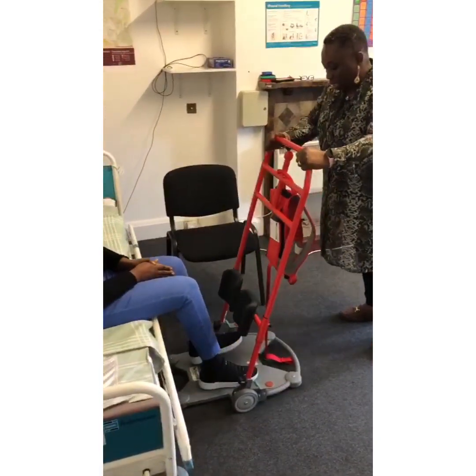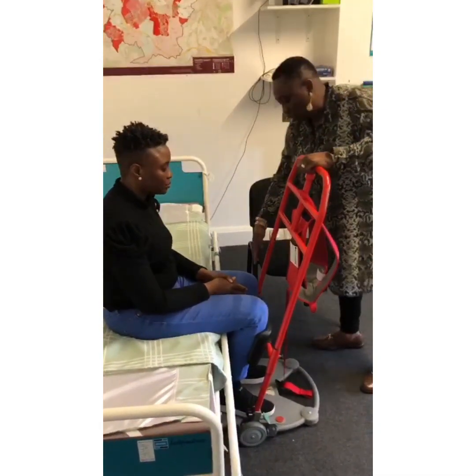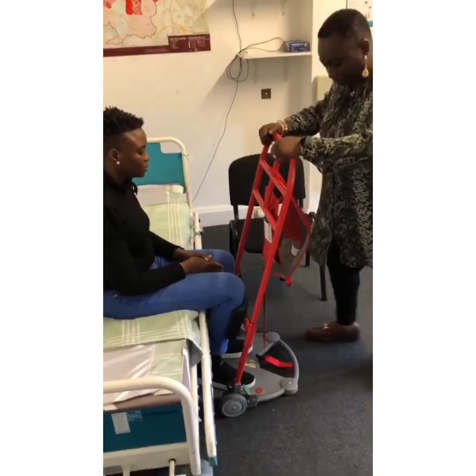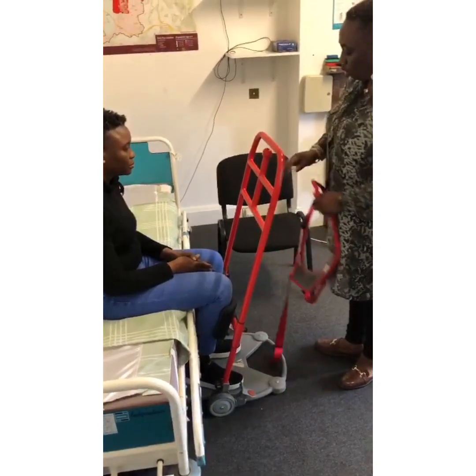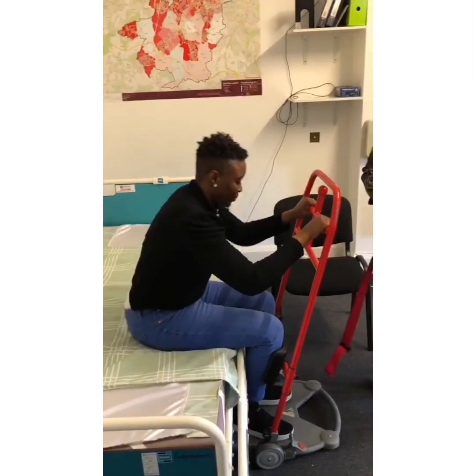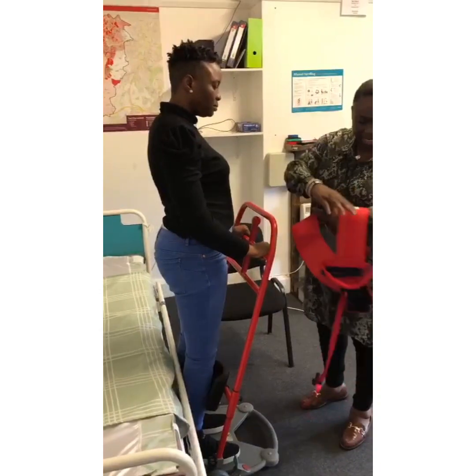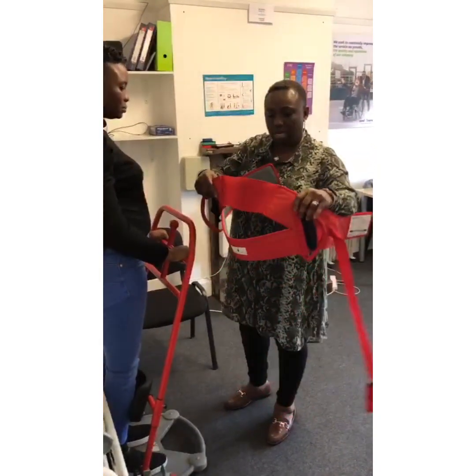Cheesab, could you please put your feet on the plate for me? Now look at the knee pads — her knee must touch the knee pads. Brakes are on; we don't want it wobbling or moving about. Cheesab, could you put your hands on the pads for me please? Are you comfortable? Can you stand up for me, please? Now this strap says 'down' and it sits on her waist to hold things in.